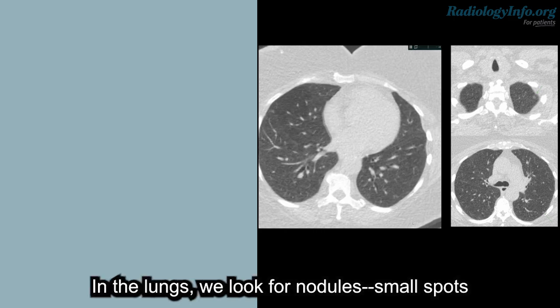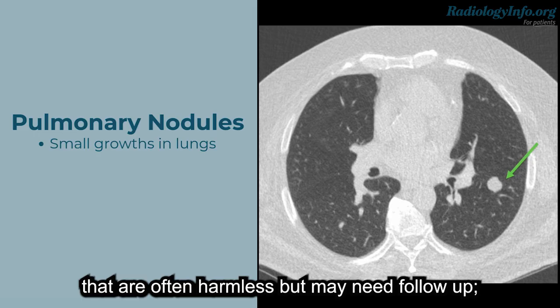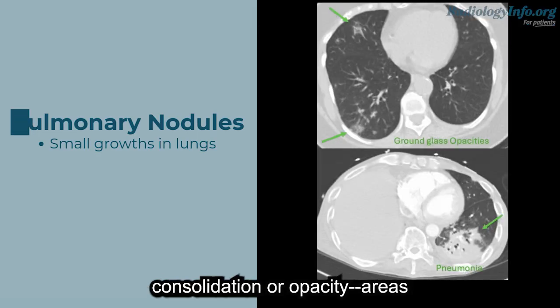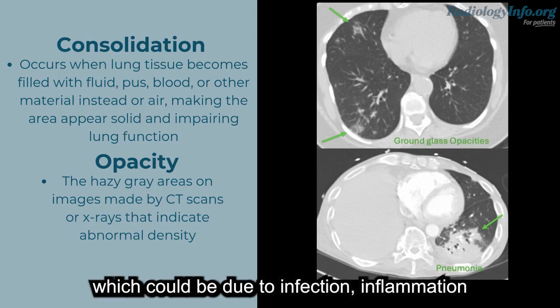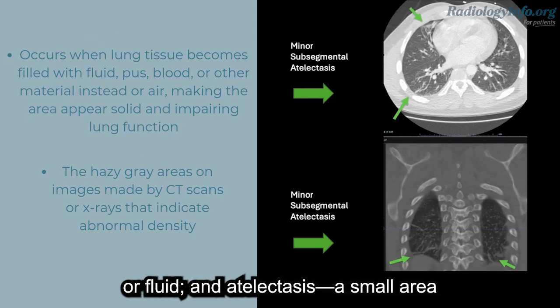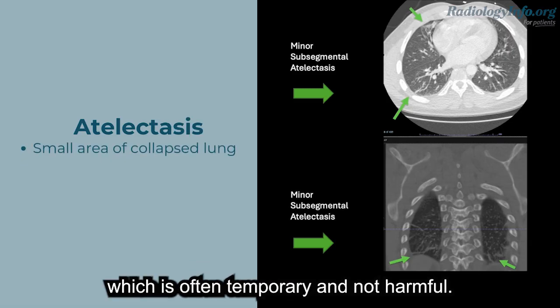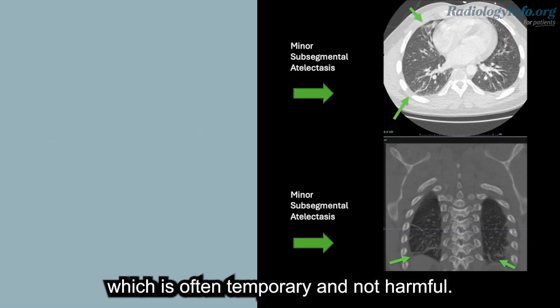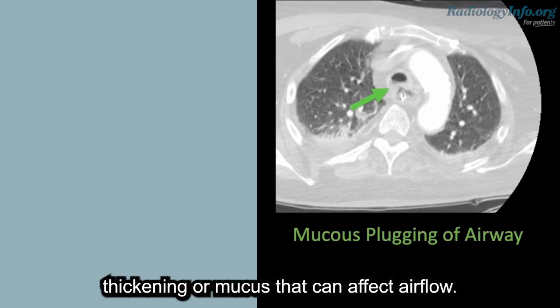In the lungs, we look for nodules, small spots that are often harmless but may need follow-up. Consolidation or opacity, areas that look whiter than normal, which could be due to infection, inflammation, or fluid. And atelectasis, a small area of collapsed lung, which is often temporary and not harmful. In the airways, we check for narrowing, thickening, or mucus that can affect airflow.